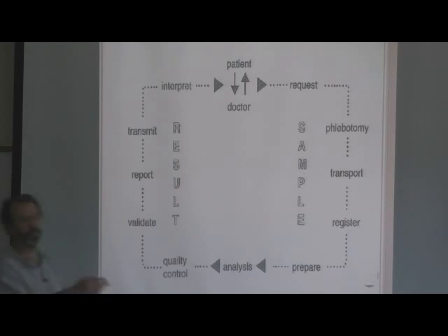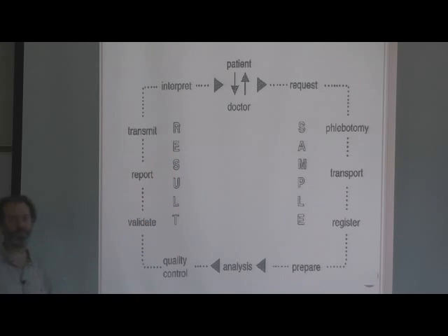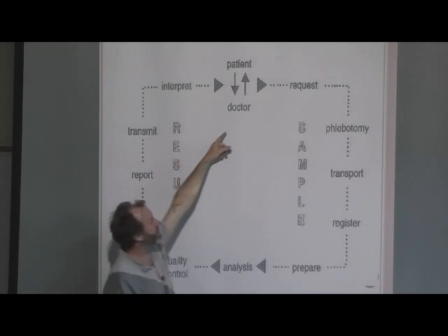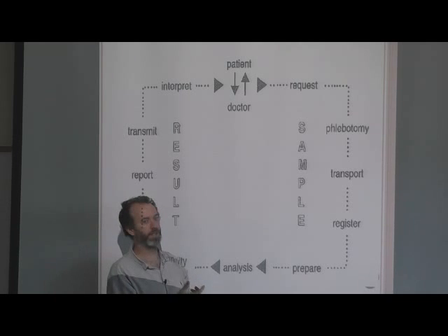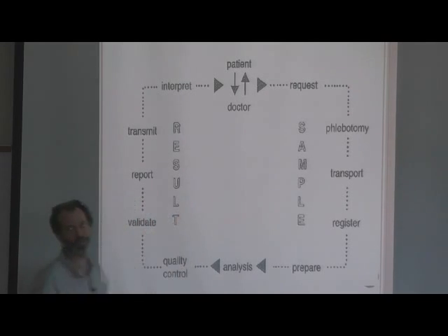So what point-of-care testing does is it basically gets rid of all of this, right? Everything down below. Basically, with point-of-care testing, you could do it right there in front of the doctor. They get the results right away, and the doctor can communicate what that means to the patient right there. So it saves a lot of time, basically, right? You think it's going to save on reagent costs? No, yeah. So, point-of-care testing.